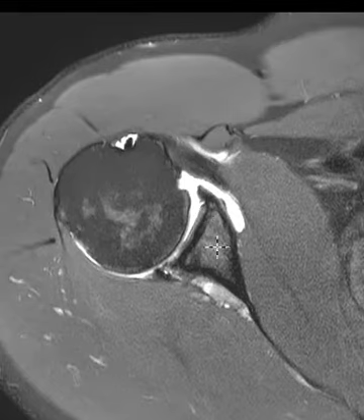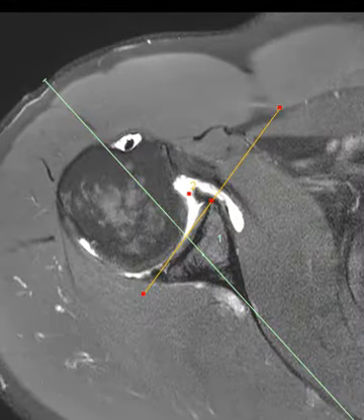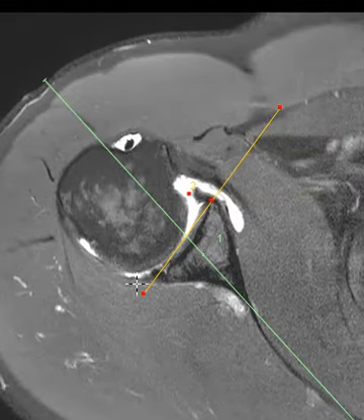We can also see that the glenoid — the angle of the articular surface should be about 90 degrees to the long axis of the scapula. So here's the scapula, and we follow that across to the midpoint of the glenoid, draw a line through the glenoid, and this should be roughly 90 degrees plus or minus 7 degrees, but his is about 15 degrees retroverted.